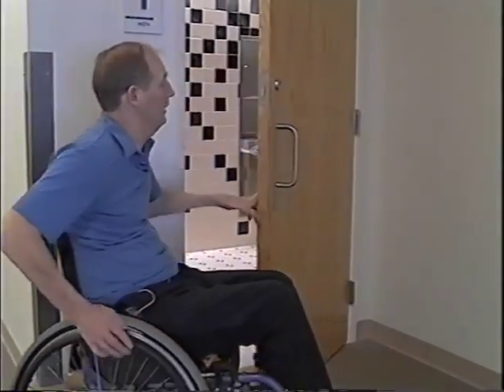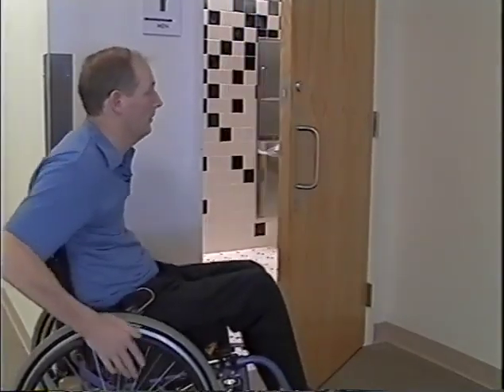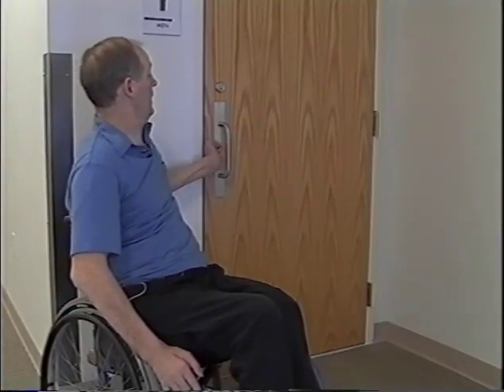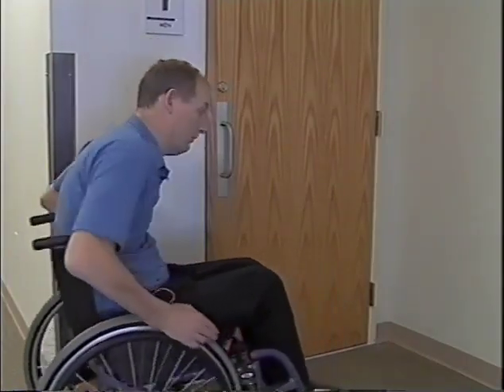As you can see, this D handle is very open. Most doors are not this accessible. And so a lot of quadriplegics, when they reach back, the tenodesis closes their hand and they can't get it into a tighter loop. This door is fine, and at the college here we couldn't find a better door. But if you are having trouble with that, you're going to want to come up to the door sideways.